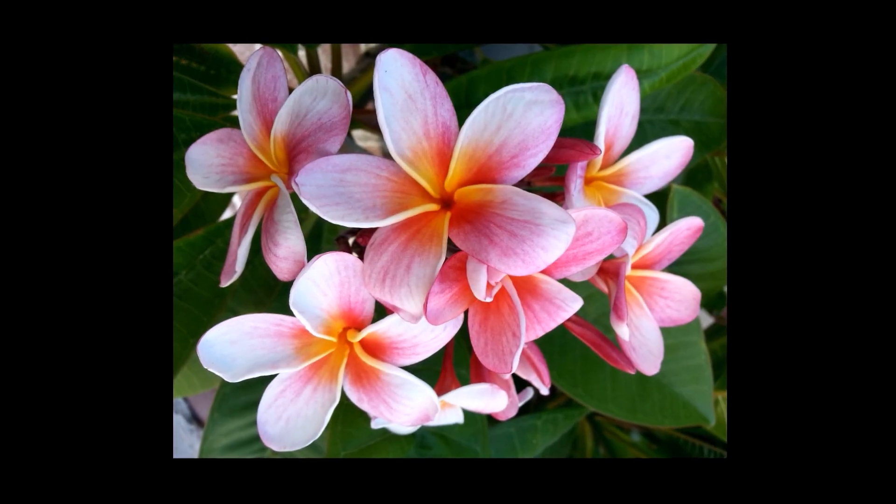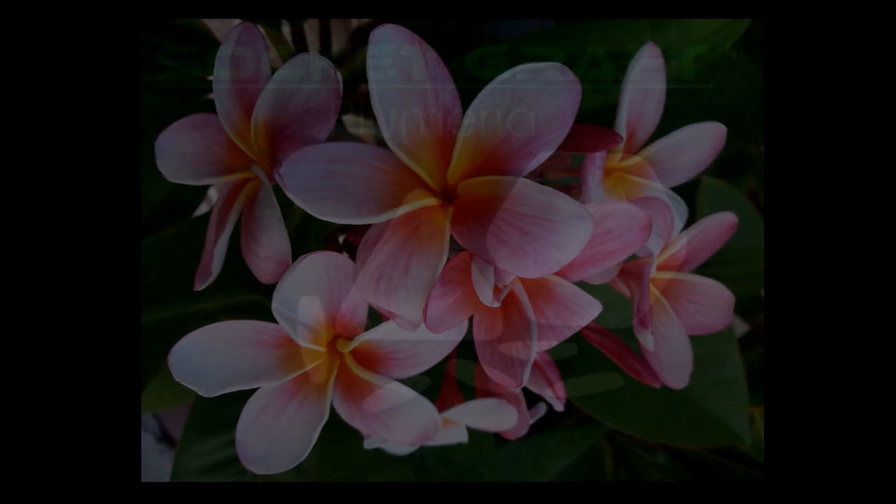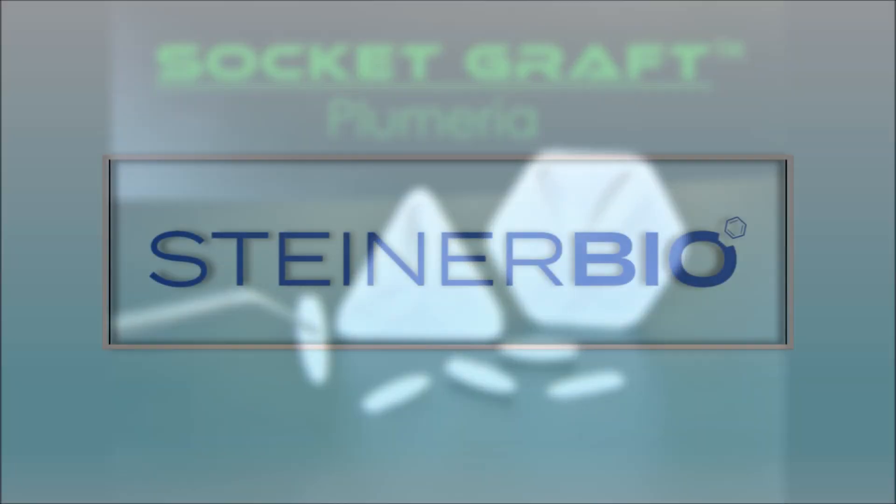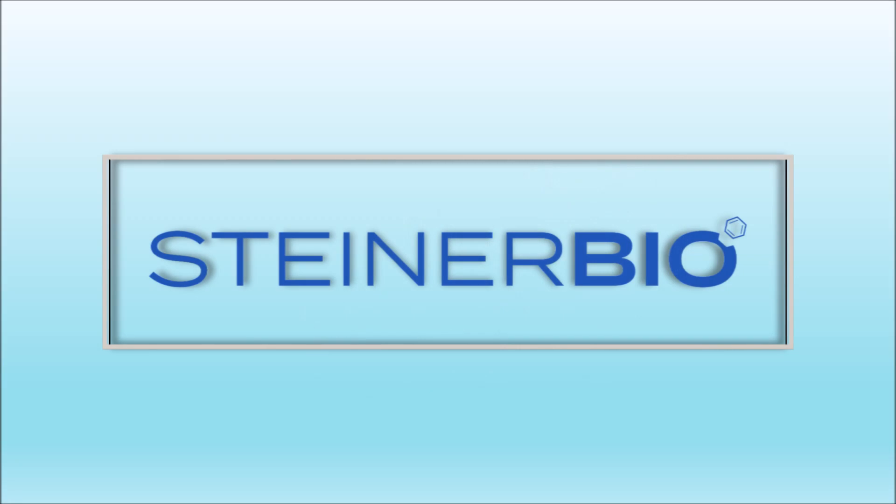Keeping with the Hawaiian heritage of our company, you can see our 1cc bone graft is provided in the shape of a plumeria flower with the bone graft forming the petals. The following is a practical demonstration of socket graft putty as it is applied to a model to show you the ease and speed of the process.